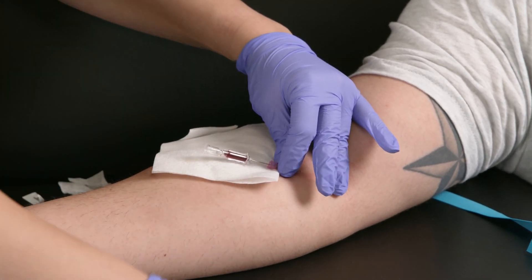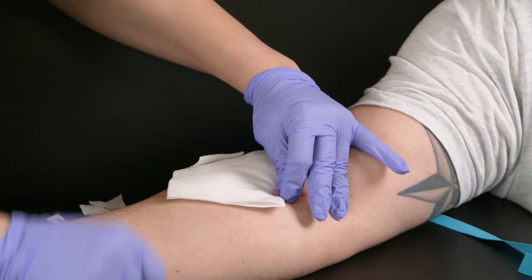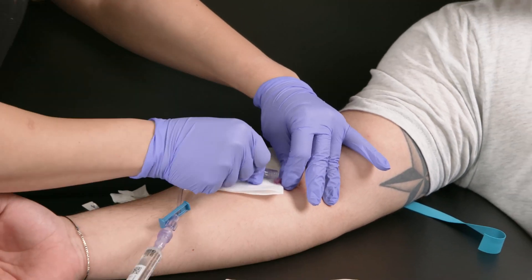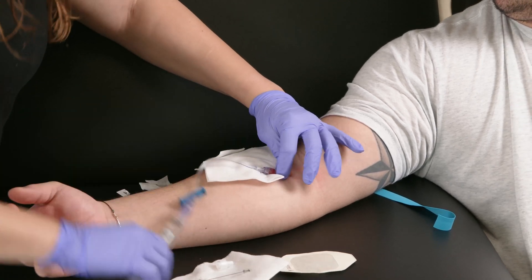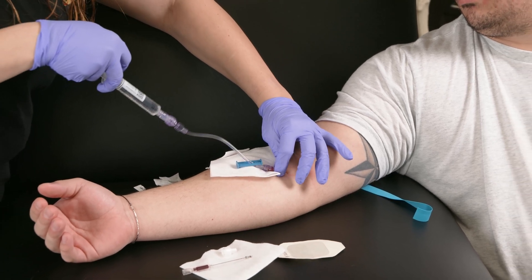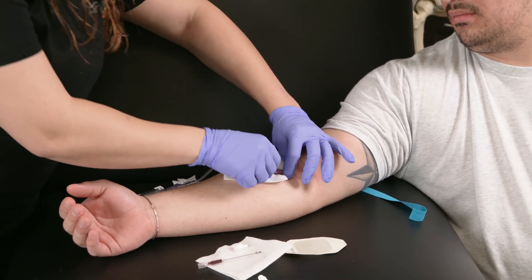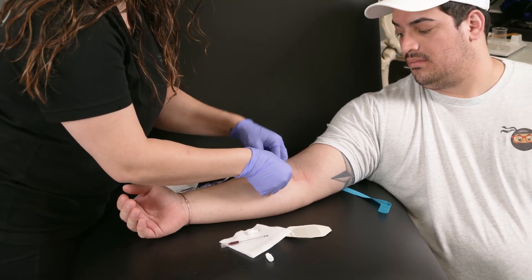Some people don't do this — this is what I do. I pop off the cap, pull the needle out, apply pressure so we don't have too much blood, and then put the cap on. Once it's in, I can pull back — I can see blood is in the J-loop. I can then push in some saline. It is in.